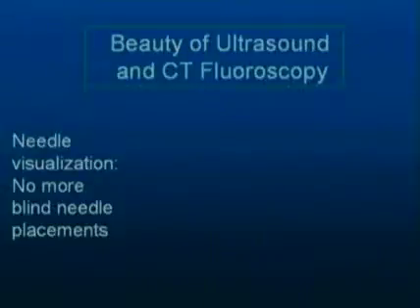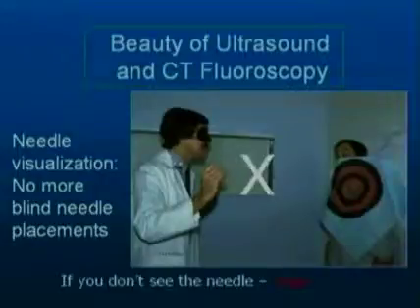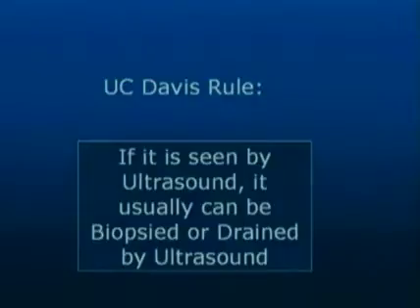The beauty of ultrasound, or now CT fluoroscopy, is we need no more blind needle placements. This is sort of a comic slide, but it does have a point. What I tell my residents or fellows is, if you do not see that needle, you have to stop. I've seen many problems arise where somebody does not see that needle, continues on, and then there is some sort of complication, perforation of a loop of bowel, or perhaps a bleeding complication. So the real beauty of ultrasound that we need to take advantage of is the ability to see the needle.